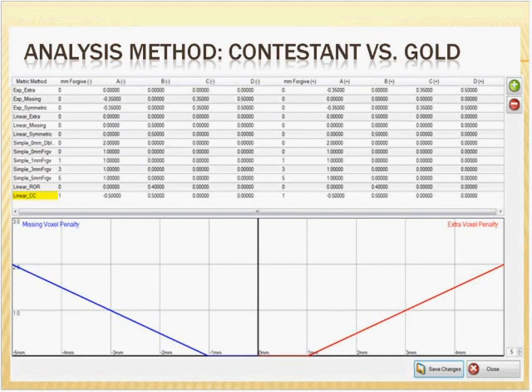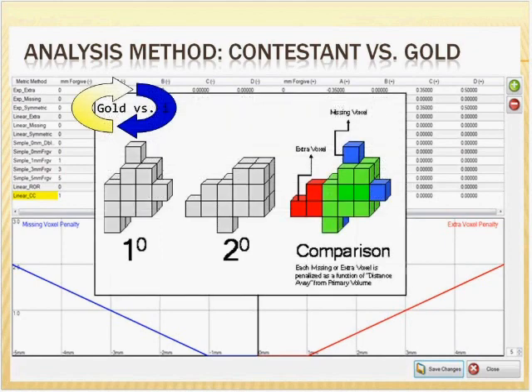Now, I'd like to point out here, Dr. Wheeler mentioned something very important. When you're talking about critical structures, sometimes it's okay to contour too much, but never okay to contour too little, especially when it's a nervous system type organ. So you can create an asymmetric penalty function where for extra voxels, if you contour a little too much, you can penalize those not at all or a lot less than missing voxels. But in this case, we did a pure symmetric because we just wanted to see what the variation is.